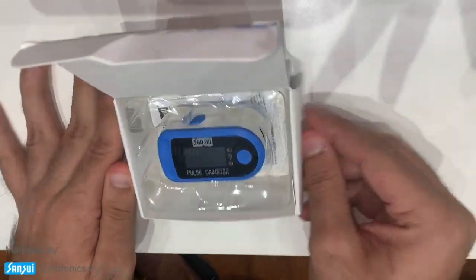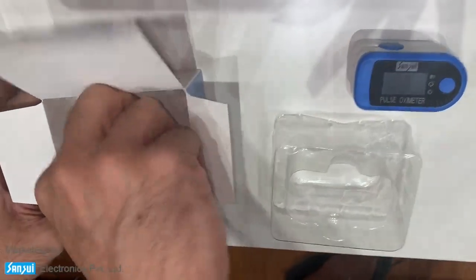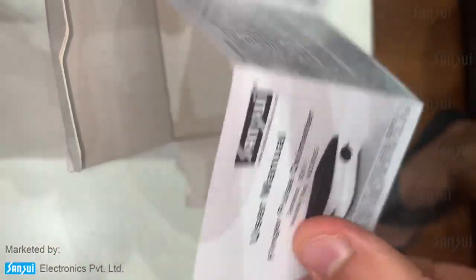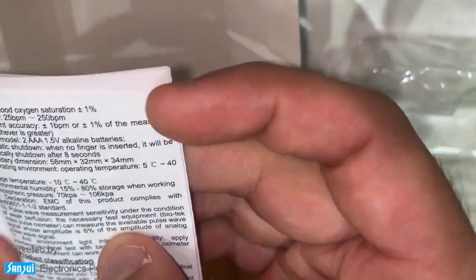As I open it, you'll see this blue oximeter inside. It also comes with a manual which gives you detailed instructions on how to use it, how the screen types are, as well as the specifications of the meter.